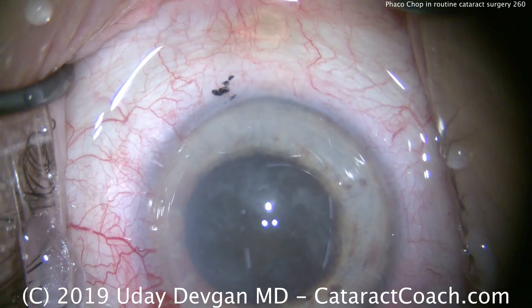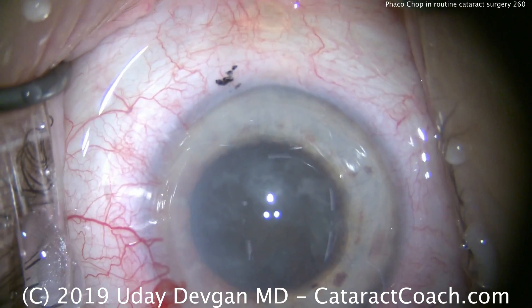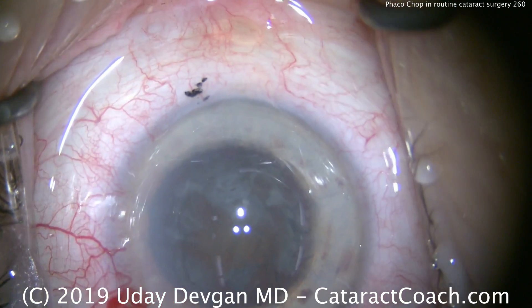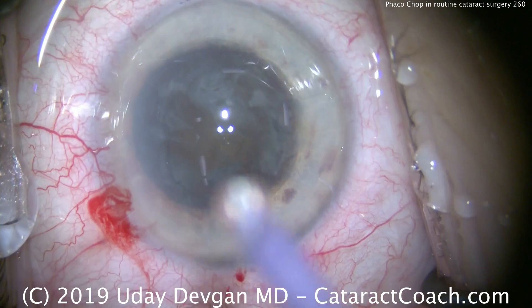You've learned my trick here — let's add a little extra aliquot of dispersive viscoelastic to protect that central cornea, because sometimes during the hydrodissection we can lose some.